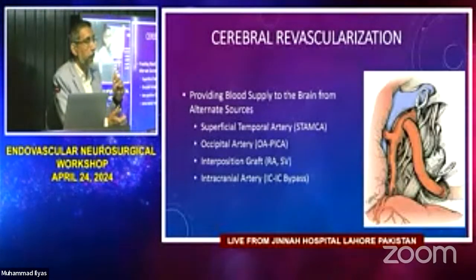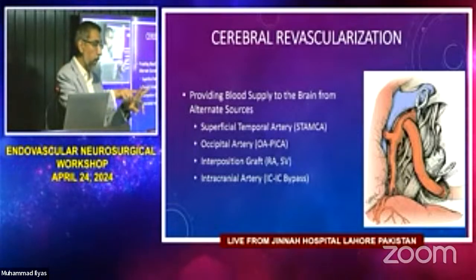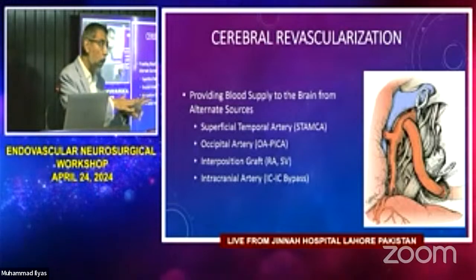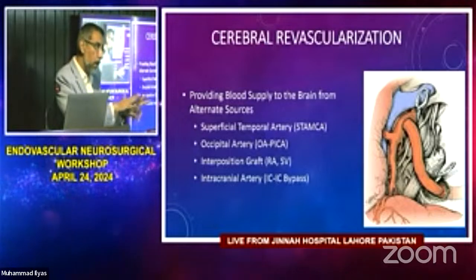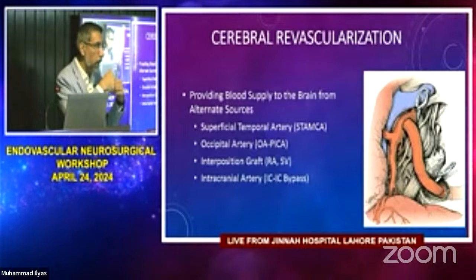Some people now have put the pipeline across an MCA bifurcation. So if you have two branches and you have an aneurysm, you can put the pipeline in one. The other one will stay open for a long time, or over time, because of distal collaterals, will slowly go down and shut down, but the patient will not get a stroke. So it will allow the blood to flow through it.